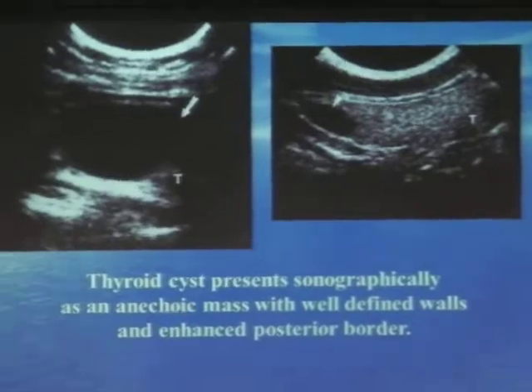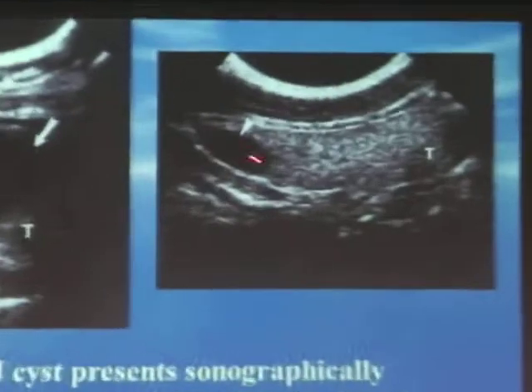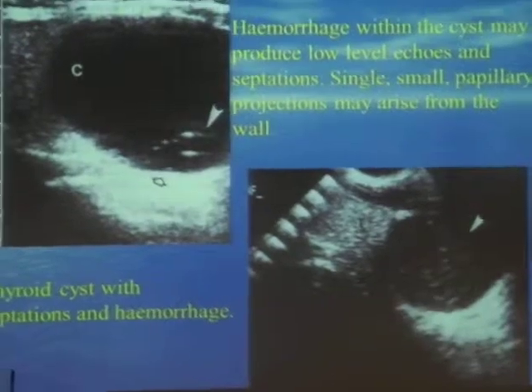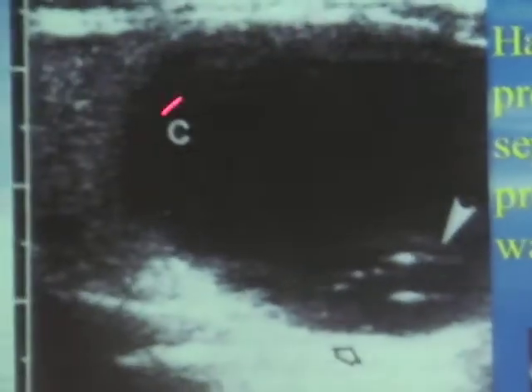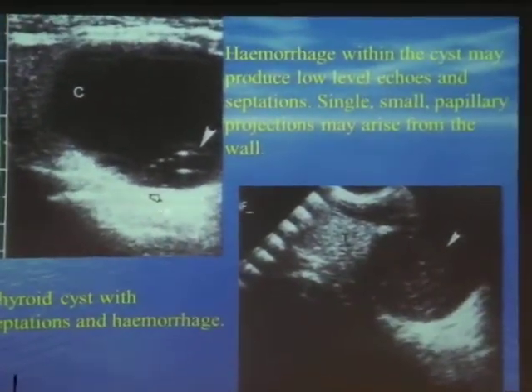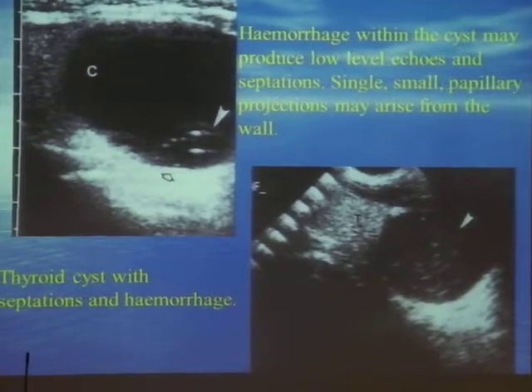So let's look at this. If you can see here, this is a simple cyst. Very thin walled, nothing at all, no debris, completely black, and that's exactly what it looks like, as compared to a complex cyst. So if you look here, like how I showed you earlier, you've got internal echoes, you may have septations, and behind every cyst or every structure in the body that has fluid, you will have an echogenic area like this, which is posterior acoustic enhancement, which confirms for you that what you're looking at has fluid inside.